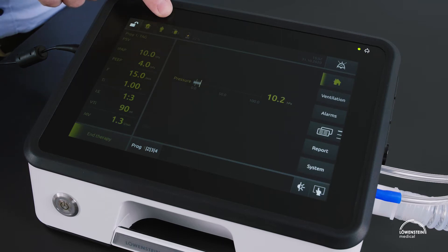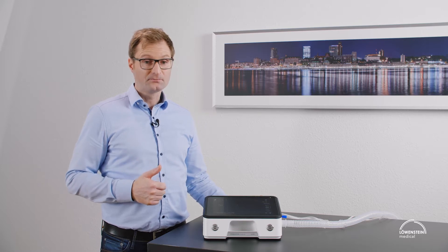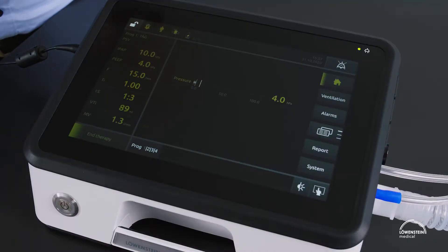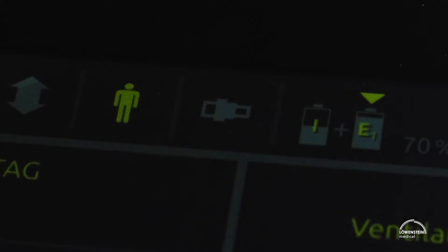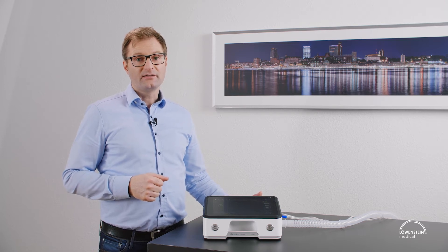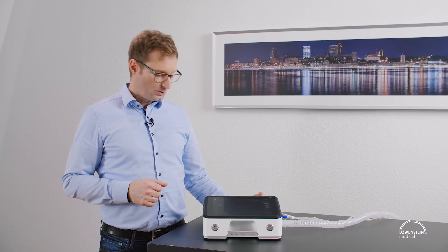Next to it is the patient type. We can set the device to pediatric settings as of 30 milliliters of tidal volume and to adult setting. The circuit type is also displayed. You can use leakage circuits, single circuits with valve, double circuits — all circuits in 15 and 22 millimeter, and the double circuit even in 10 millimeter up to 50 milliliters of tidal volume.